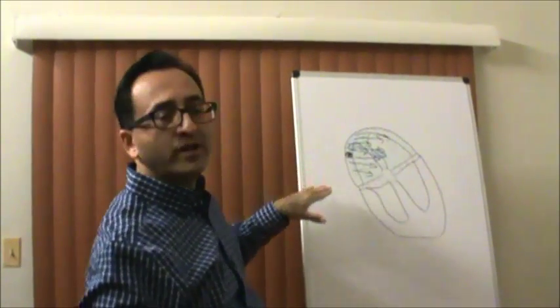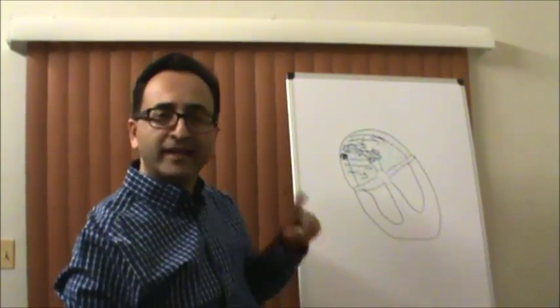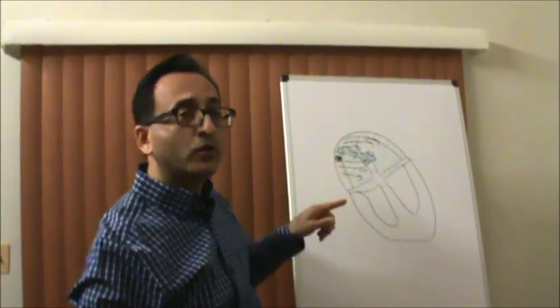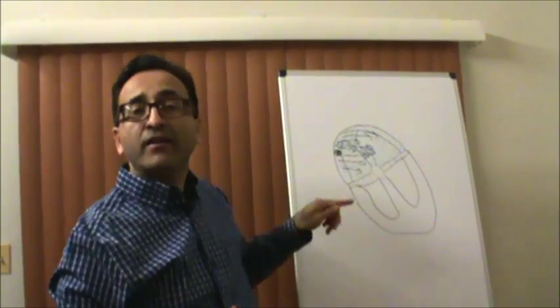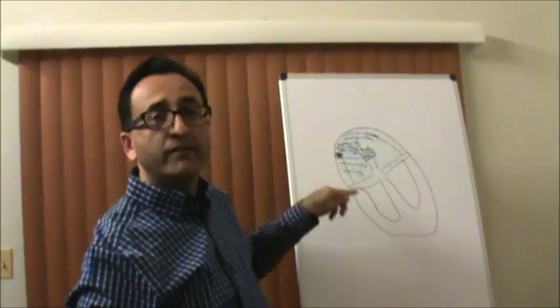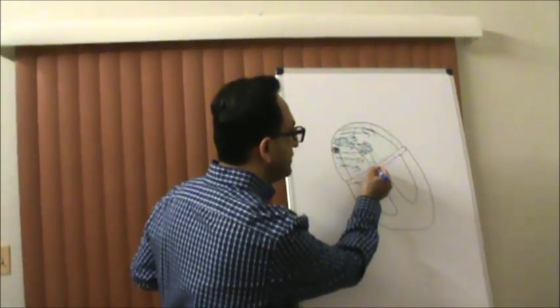After the depolarization of both atriums, nothing goes through to the ventricles except there is one window, and that window is the AV node. So the next electrical event that occurs is the AV node. So that is this one.